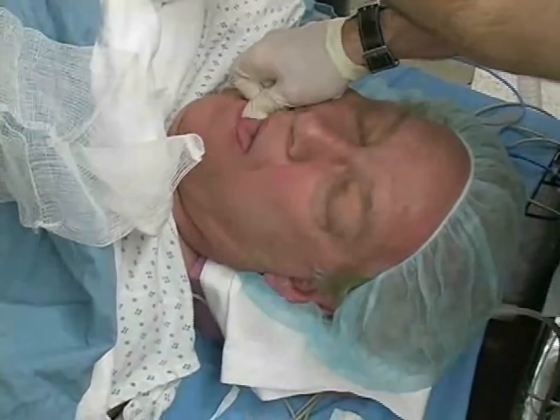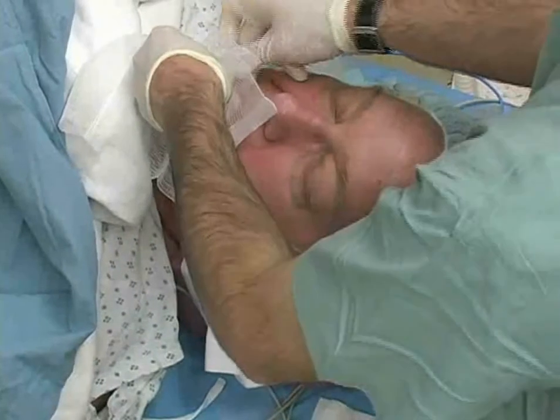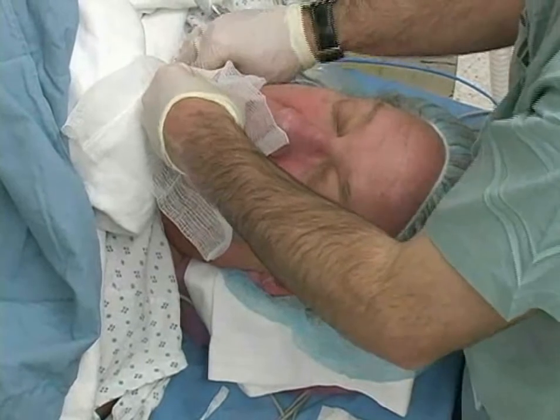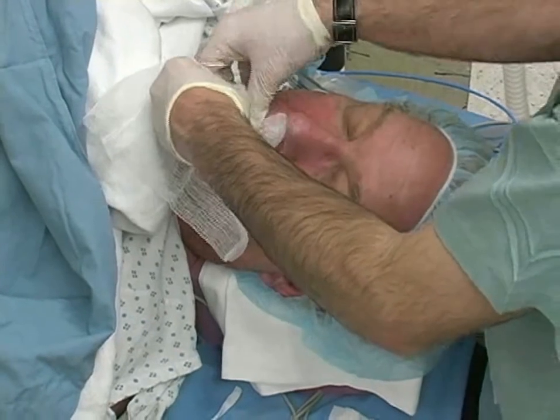Using the 4x4 gauze, gently grasp the patient's tongue and hold it slightly outside of the mouth to maintain a patent airway. Continue to hold the tongue until the patient emerges from general anesthesia and can maintain his own airway and breathe spontaneously.